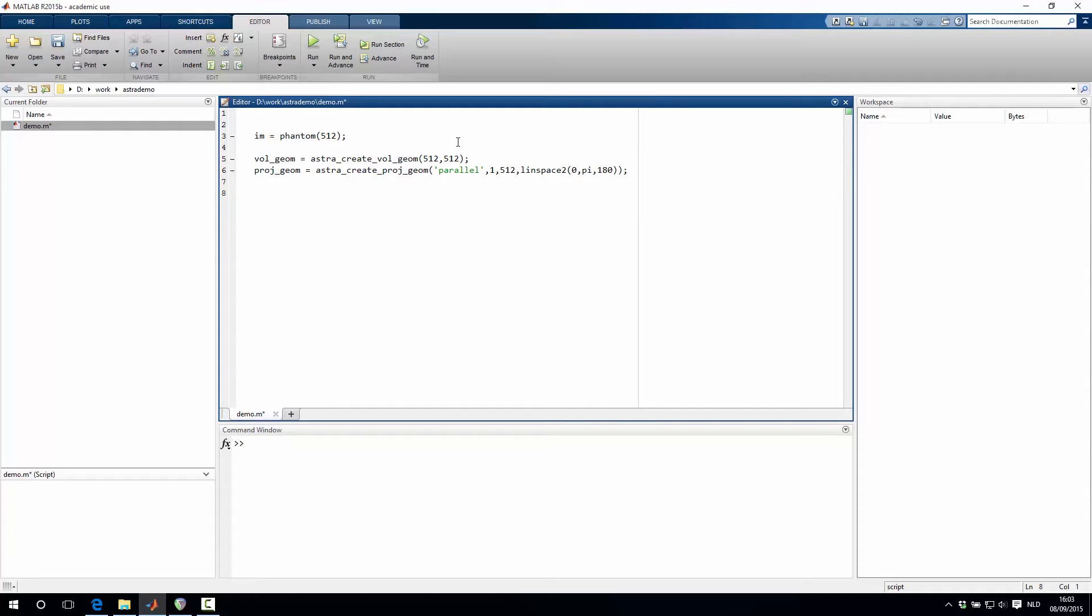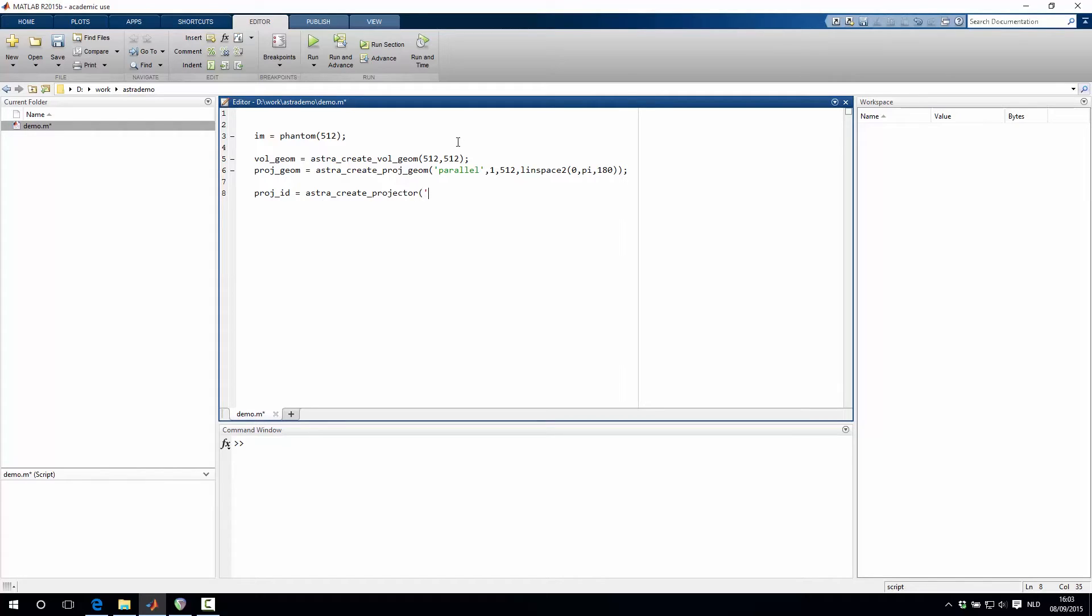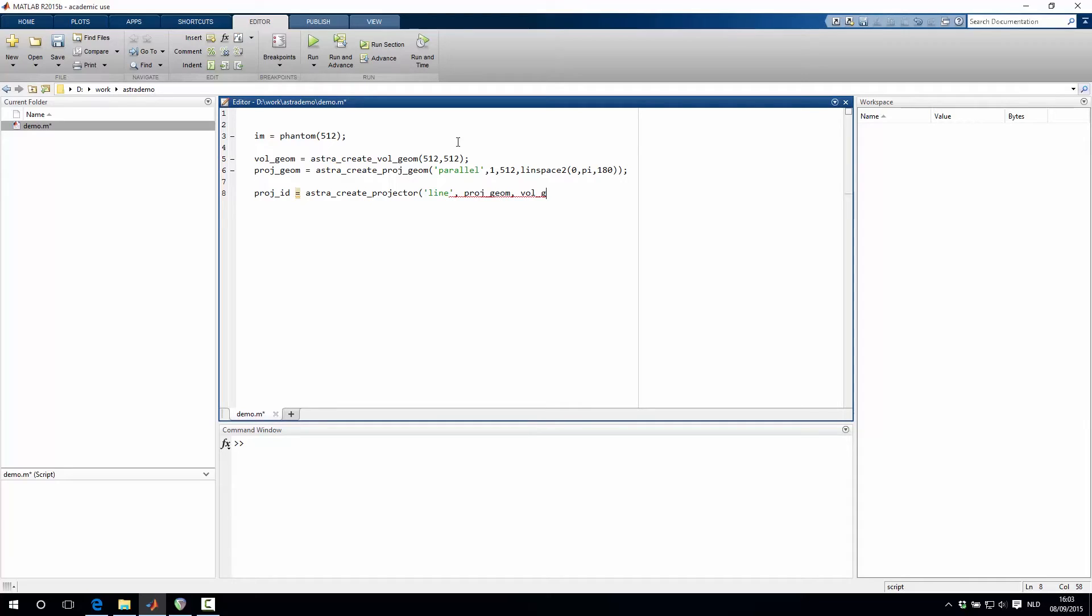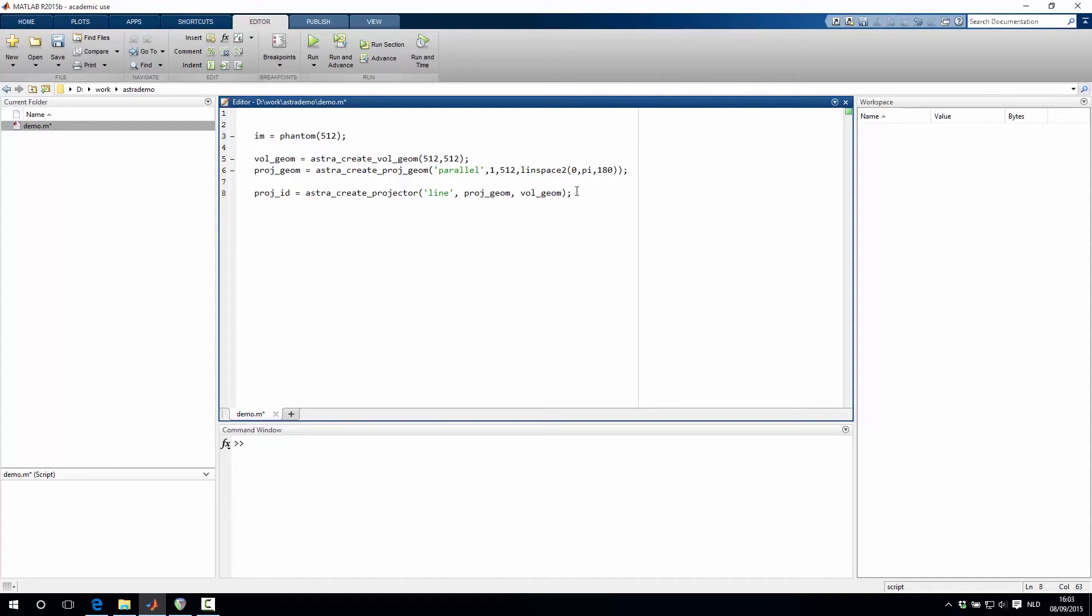The next step is to create a projector, so we type astra_create_projector. We then have to specify what type of projector we want, so let's say we want to use a line kernel, and then we also have to add the projection geometry and the volume geometry objects that we've just created. And then the result of this function is a projector identifier, which we can then subsequently use to refer to this projector.